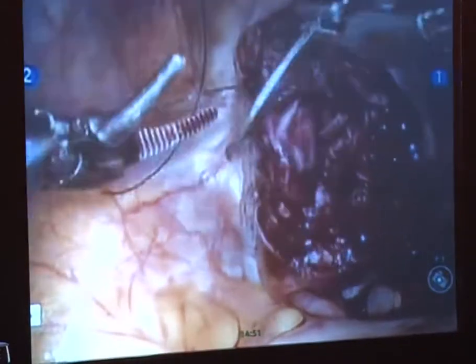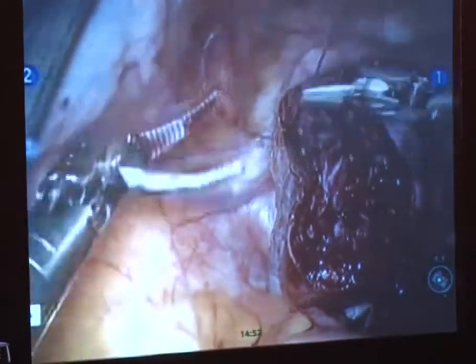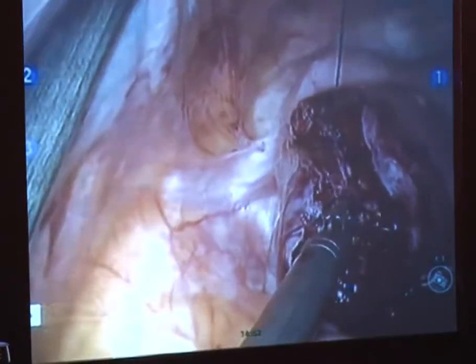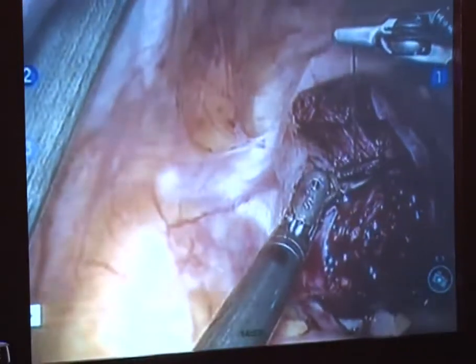Notice this is all nice and healthy tissue. It's nice and pink. It's not overly bleeding. It's closing very nicely. The suturing is well-placed sutures, which I think is very, very important to have. And I think that this will heal fine.